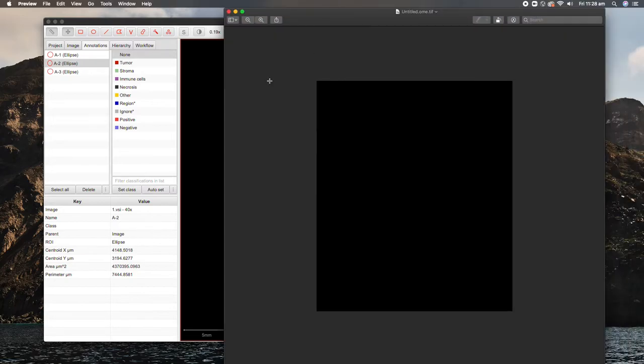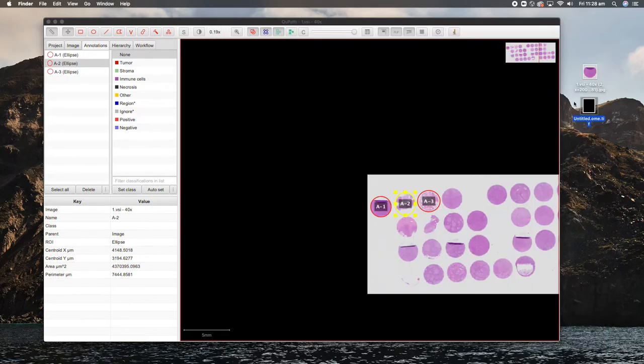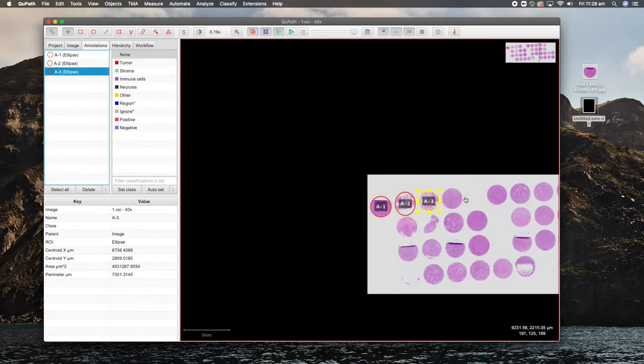So you can see the OME TIFF is not coming out with much of anything. That is because it is expecting a 16-bit file, and it's not, so it doesn't have the dynamic range that we need. But if you're happy with JPEG, then you can literally just repeat that process for each of these in turn, and each of those will get saved out as a separate image with the file name of the actual core number that it is. Let me know if that helps.